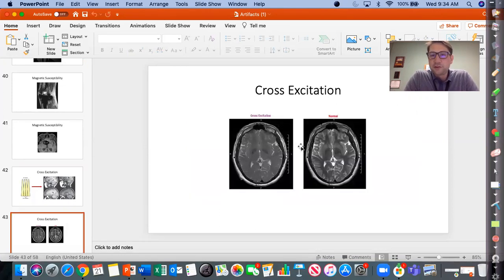This image I already showed you before, and just look at how low contrast of an image this is, and then higher contrast, where we're able to see the white and gray matter easier. That CSF fluid is nice and bright.